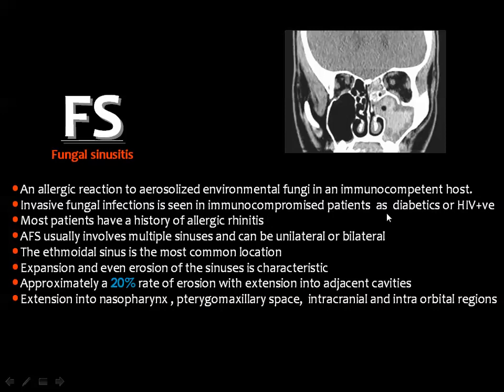And they say usually that invasive fungal sinusitis is diagnosed by the presence of extensive bone destruction and invasion of the surrounding structures, while allergic fungal sinusitis has an expanding nature and less bone destructive changes.